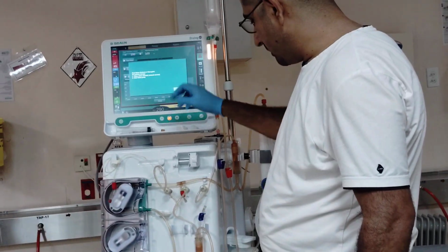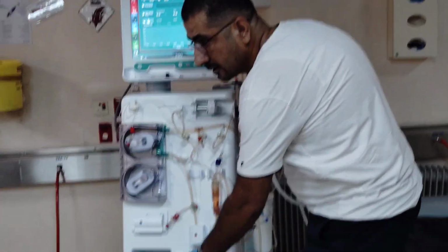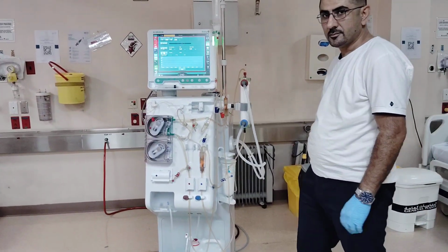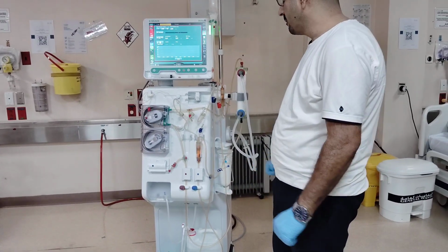again, after I finish, just press okay and start the blood pump. I just start, then again it will pump. Oh, correct, you need to unclamp there first. So no need to close any clamp manually.